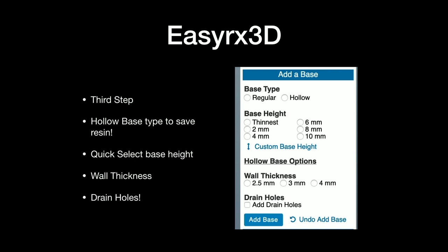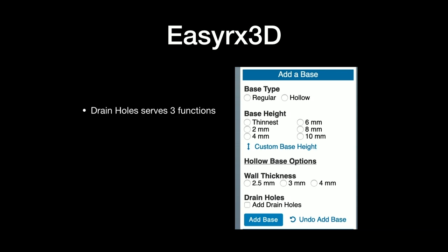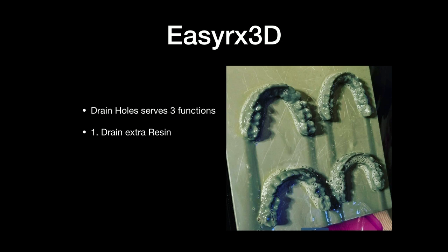And then, of course, drain holes. And I need to talk about drain holes because the drain hole serves 3 functions. Drain extra resin. So these are hollow models. They got drain holes under here. When I get out of the printer, I just tilt it, give it a few minutes, and all the resin drains out. And I capture it in a little Tupperware that I stole from my wife. And then I just dump it back into the 3D printer, and I kind of keep up. I don't use as much resin.